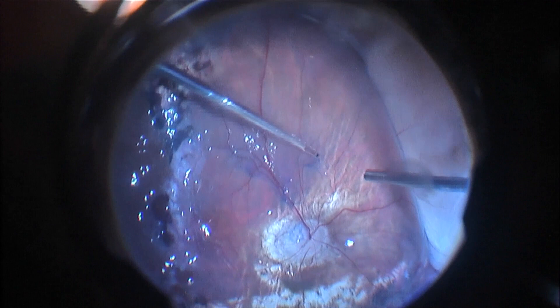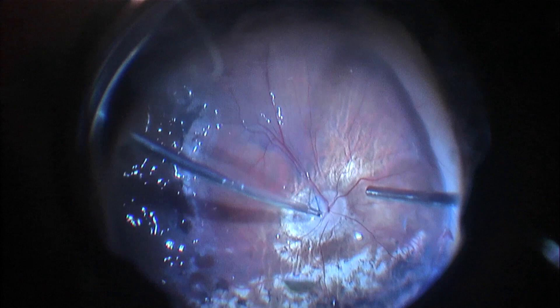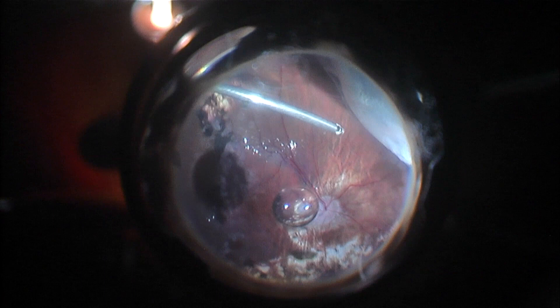Now under PFCL I am removing the remnants of the pre-retinal membranes and ILM. I can confirm that the ILM was already peeled in the macular area. Now I am shaving this vitreous after dissecting this tunnel.